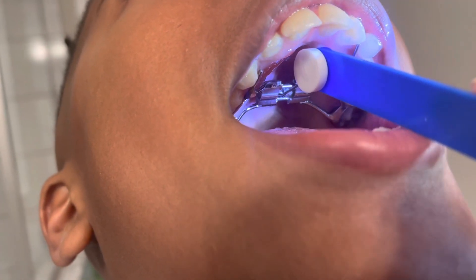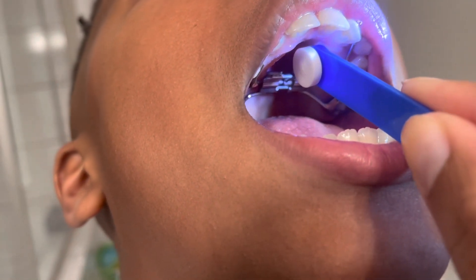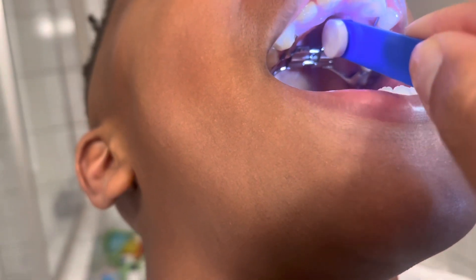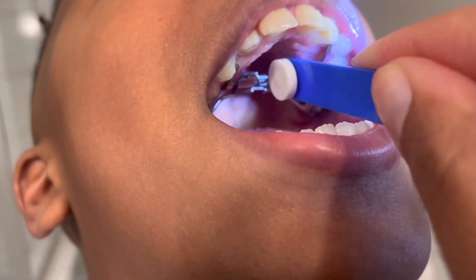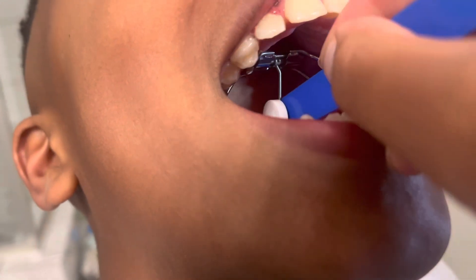So we got spacers for a few weeks and then the expander was put in. Now we're going to show you what it looks like when we turn the key. I do this every other night. We have the key that they've given us, and you take that key, place it into the hole that you see in the expander, and you actually move it back — rotating the hole and pushing it back towards the back of the mouth. Once you push it, you'll begin to see another hole appear and then you stop. You do one turn every other night, which is what we were told to do.